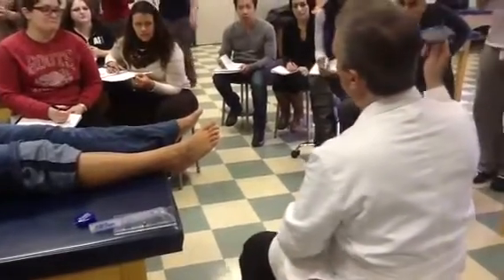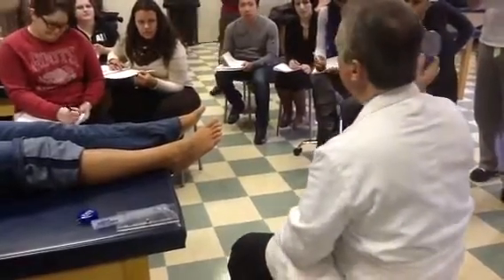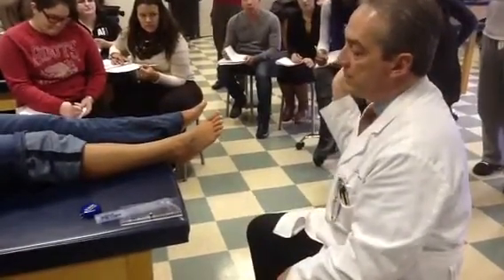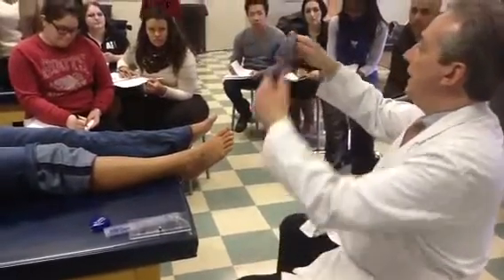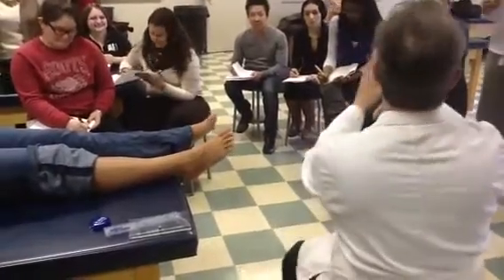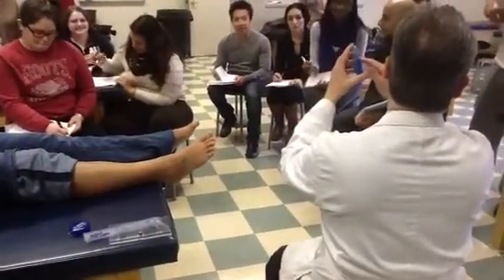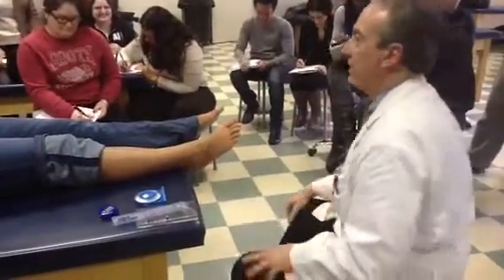You can get this at any Home Depot, Lowe's, any hardware store typically has these. These are also handy. That one you see says angle finder on it. So it does. Angle finder. Good. Very good.